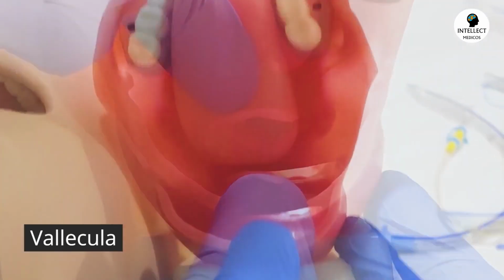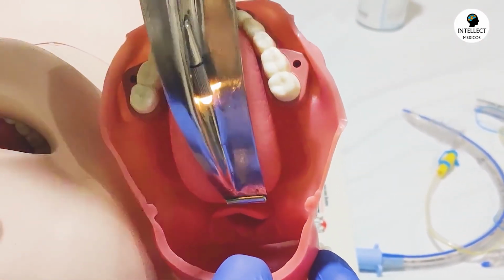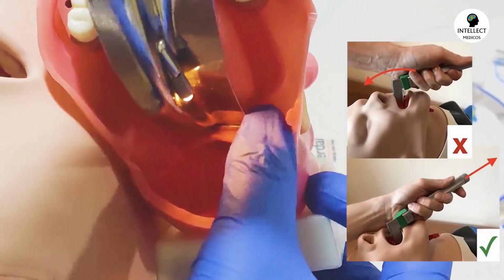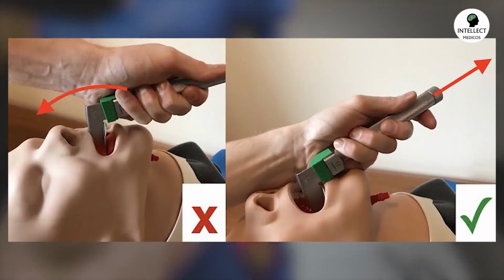I have to get the tip of my laryngoscope till the vallecula. So first of all, I'll go like this, deviate the tongue, and I'll go over here. Now the movement of my laryngoscope should be like this, as shown in this pic.